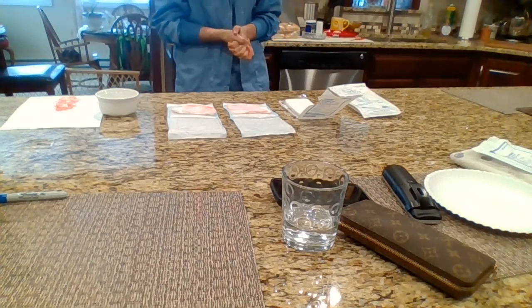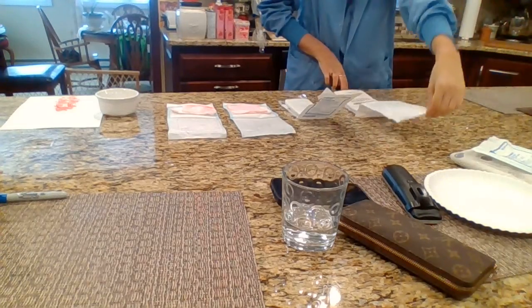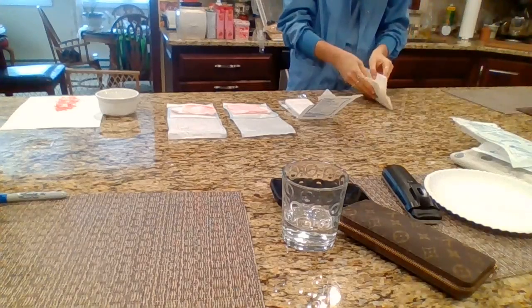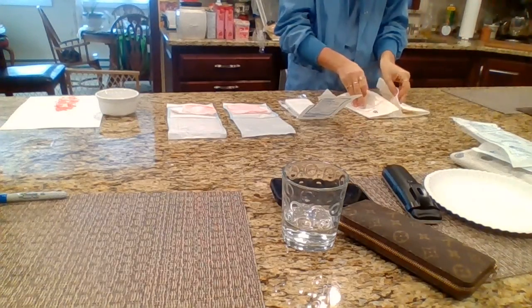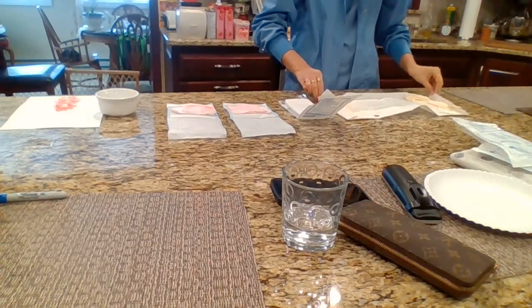Okay, so after that's done, I'm going to don my sterile gloves. So the first step is to fold down the 1-inch border.